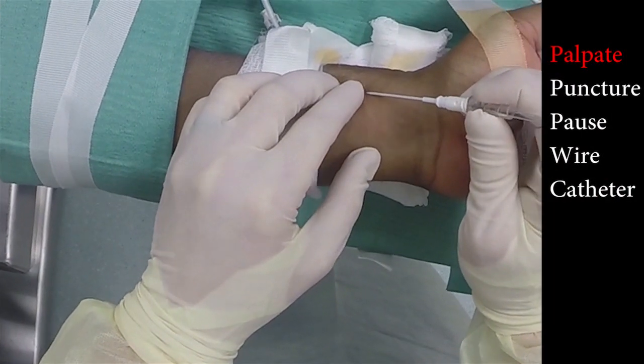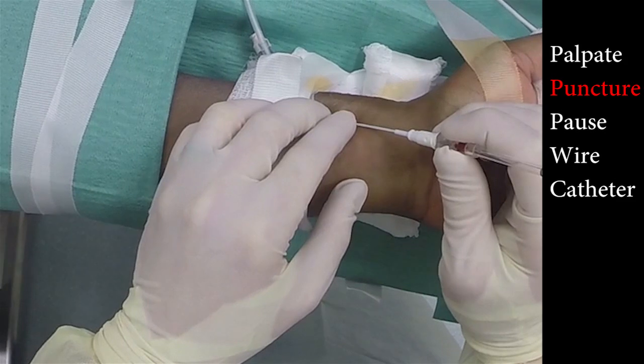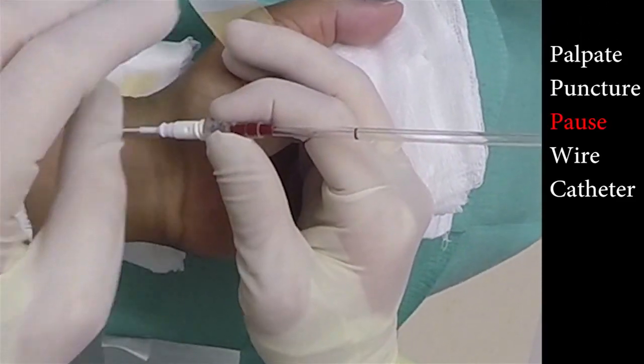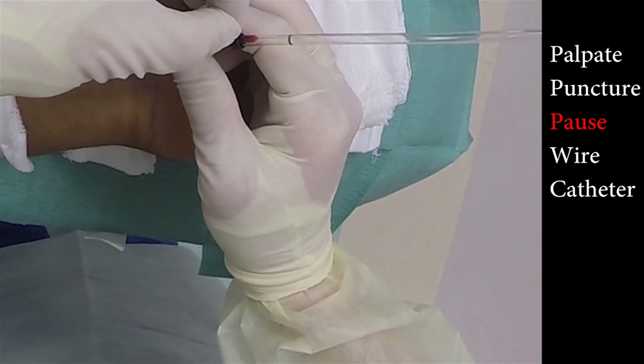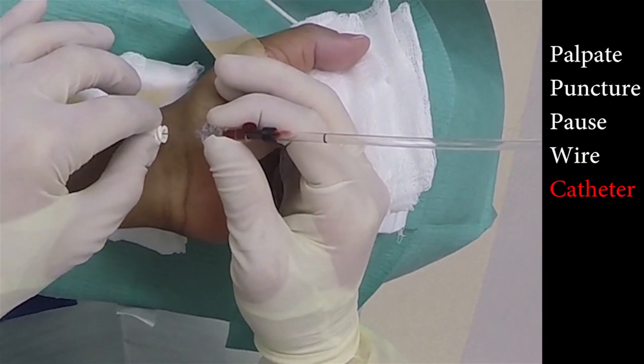This next clip will be played at full speed. Step one: palpation. Two: puncture. Three: pausing — notice the hesitancy as the column stops rising and the readjustments made. Four: wire easily inserted. Five: twisting off the catheter.